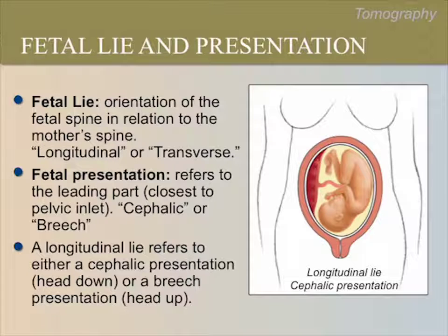Another possibility is that the fetal lie is transverse, which means that the baby is in sideways position, with its head towards one of the maternal sides. A transverse fetal lie, or a breech presentation, can complicate delivery.